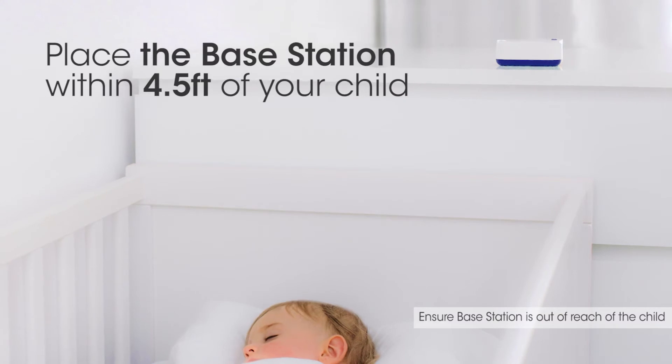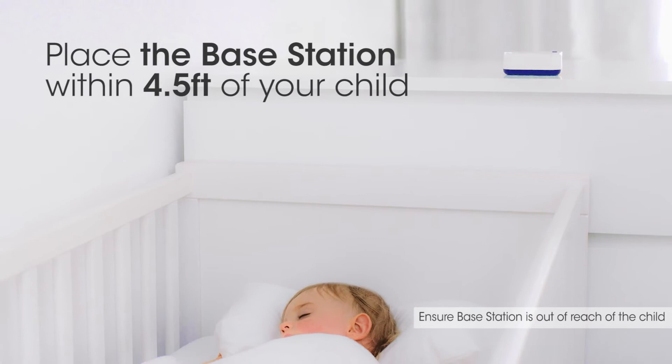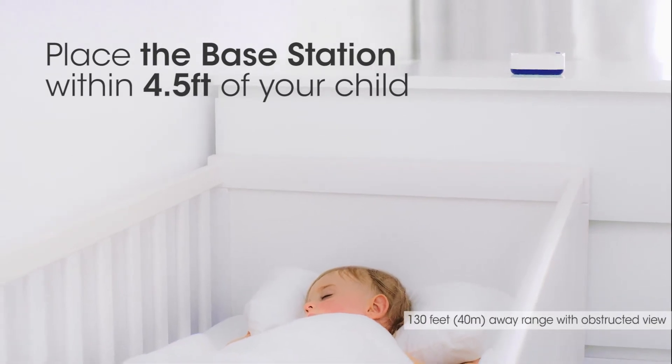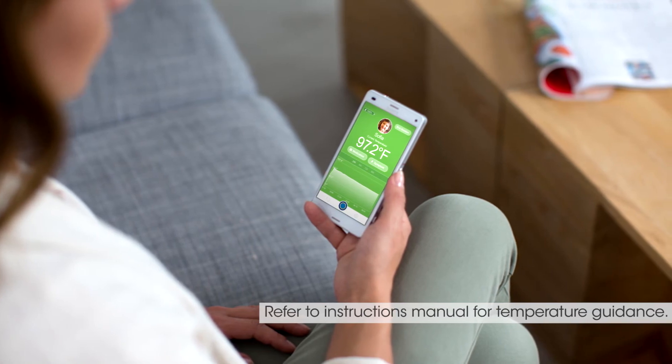Remember to place the base station within 4½ feet of your child and the monitor. This boosts the Bluetooth range so you can get readings up to 130 feet away. Your child's armpit temperature will then show.